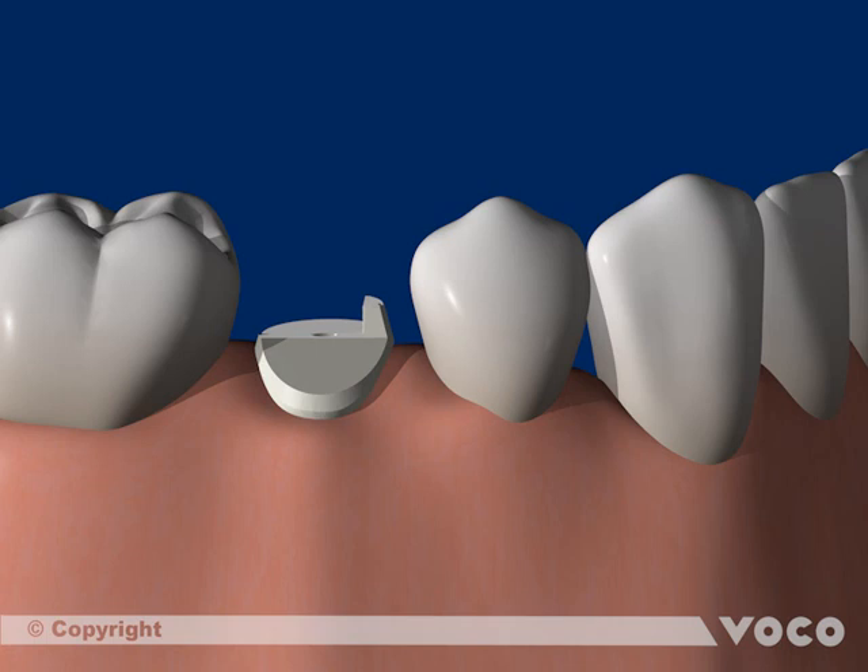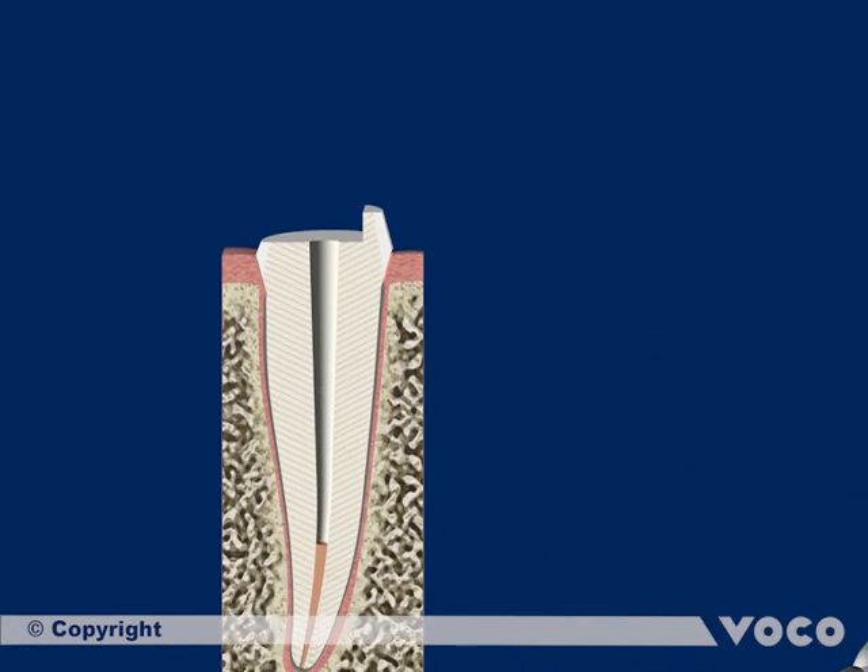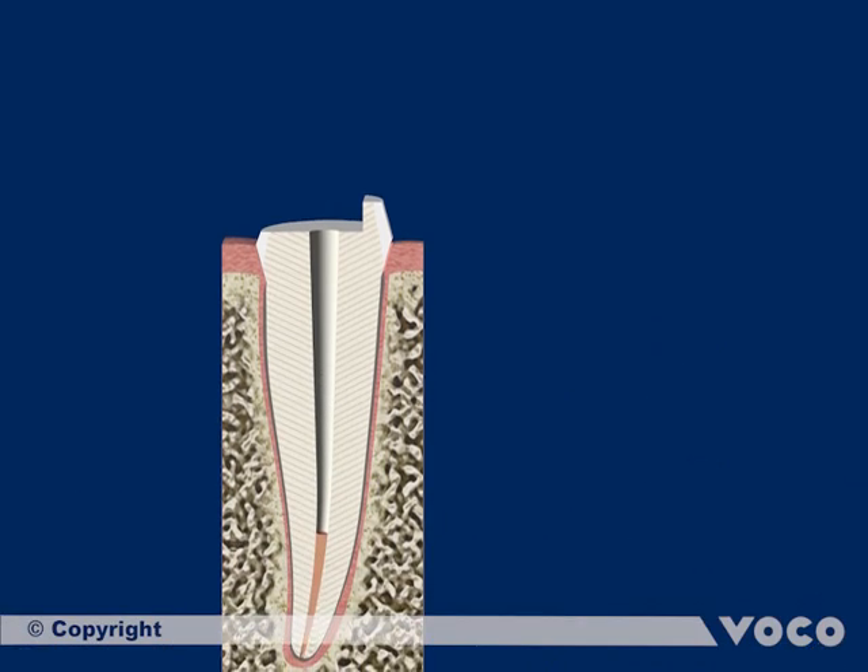The endodontically treated tooth, previously filled with gutta-percha and sealant, has been prepared for the fixation of a root post. The root canal filling was removed with a drill corresponding to the root post in diameter.